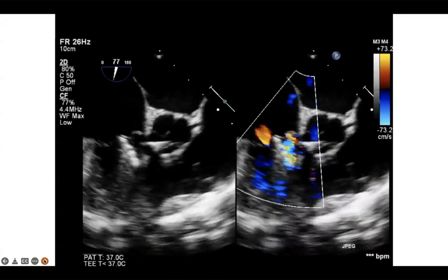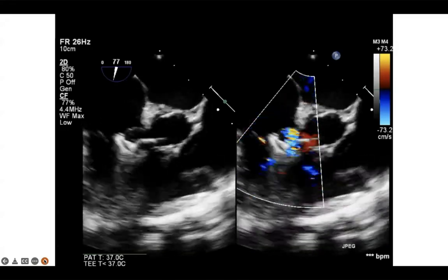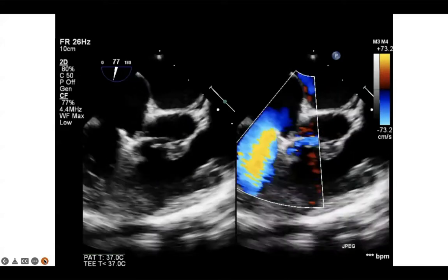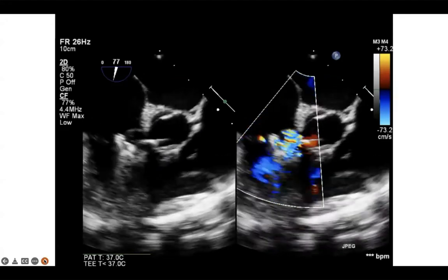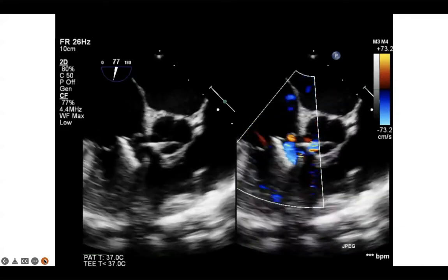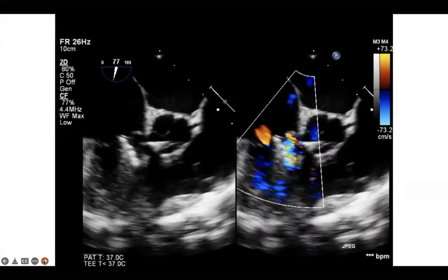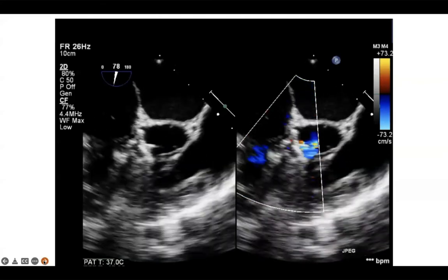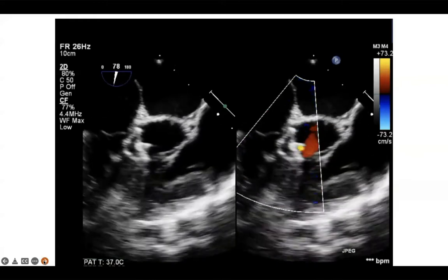Okay, and this is what things look like. There's certainly less tricuspid regurgitation now. You can still see, because of the length of the tunnel of the VSD, that the RV disc still looks as if it's not in beyond the septal tricuspid as much as one would like. And there's the LV disc cone deployed with really probably very little residual shunt at that point.